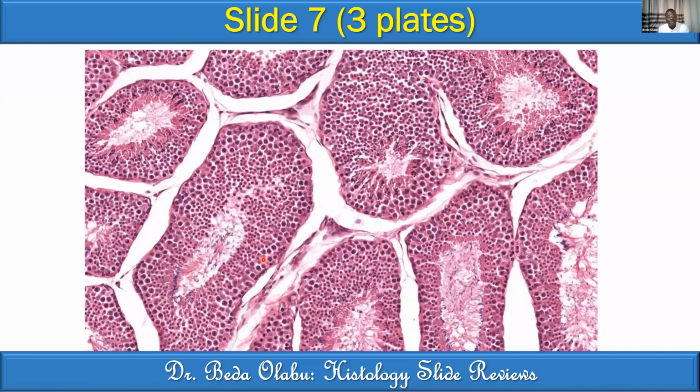So remember those endocrine functions of the testes. Remember, interstitial cells of Leydig produce androgens, and in the lecture, you know which ones are testicular androgens.